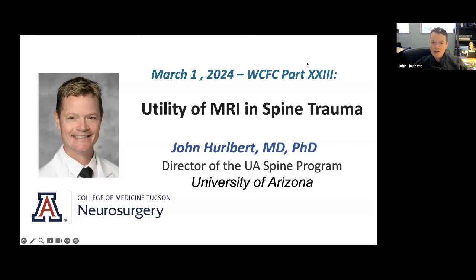If you want to get an MRI and follow the algorithm and then put that patient into an indeterminate category, fine. But do it based on the biomechanical principles I'm describing, not based on one-dimensional or two-dimensional interpretations of a single ligament. In an area this big, when the ligamentum flavum in an AP view should fail over an area this big, keep those in mind. Radiologists don't get that. And then if you're still unsure, for me as a spine surgeon, I'm not going to take that TLICS 4 to the OR. I'm going to do flexion extension views.